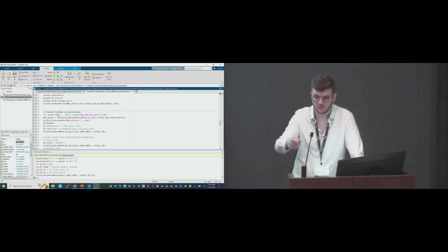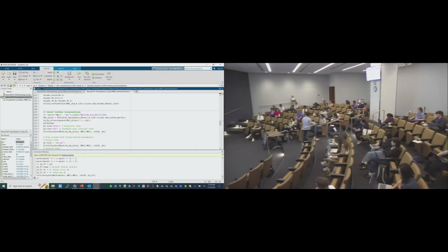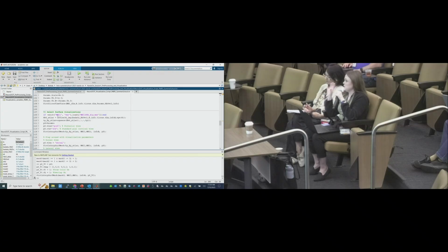We've got another one up here in the front. My question's kind of going backwards. With what we put into this script, you had already pre-processed it, and then you also had image reconstructed it, which we're not doing. Yes, we're not doing that, and the step after that I did not mention was spectroscopy, which goes from measurements, or optical density values, to concentrations of hemoglobin.